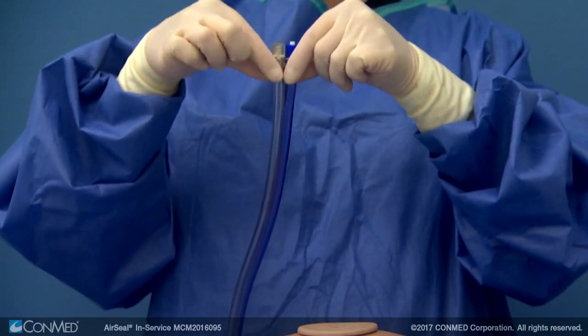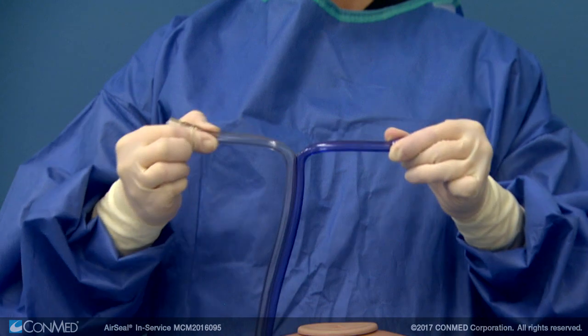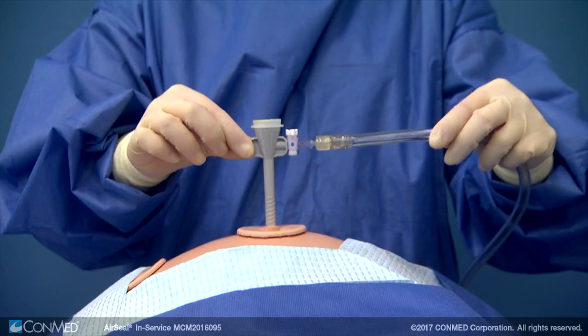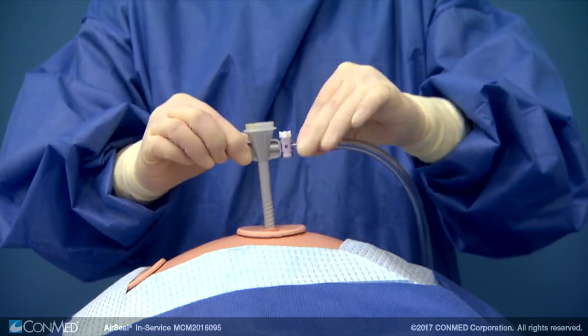Because the two trocars needed will be several inches apart, you will need to partially separate the clear and blue tubes from each other. Insert the first trocar or Veress needle and connect the clear tube to its stopcock.